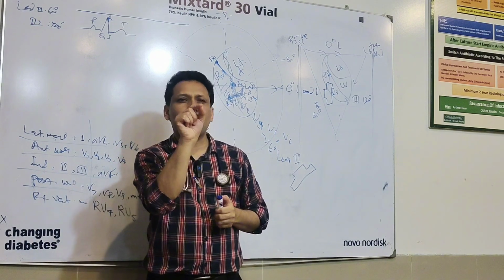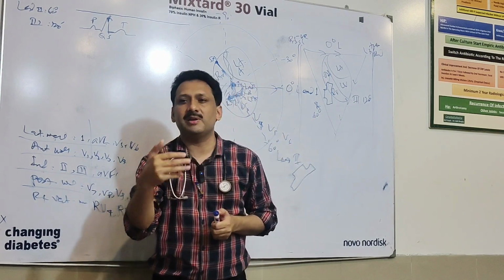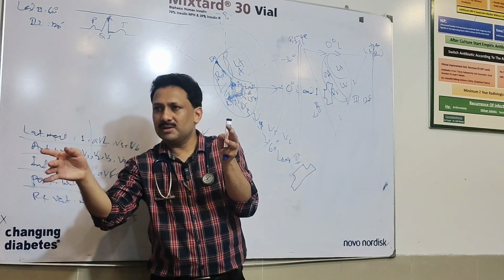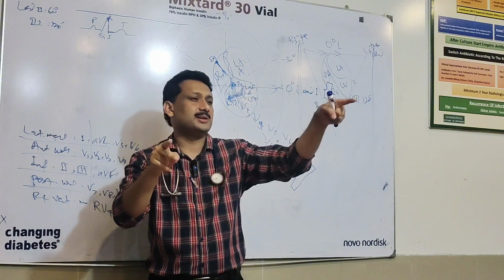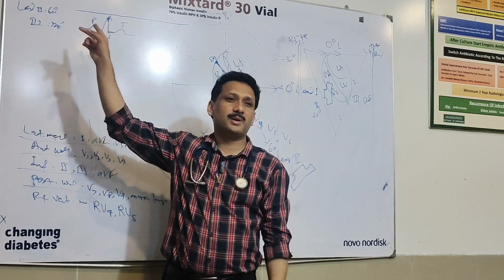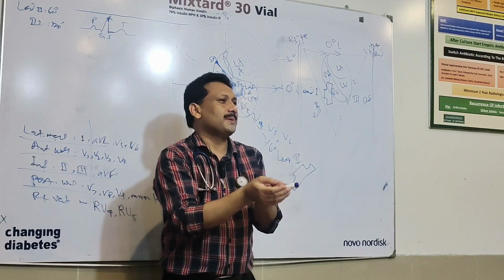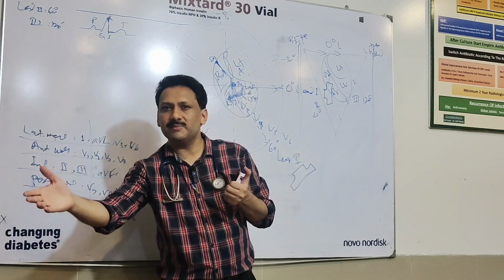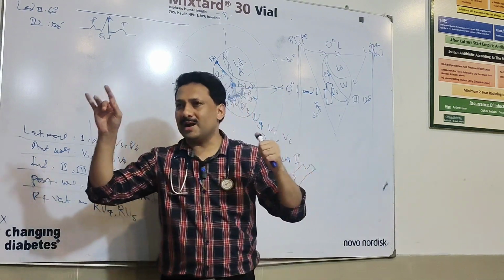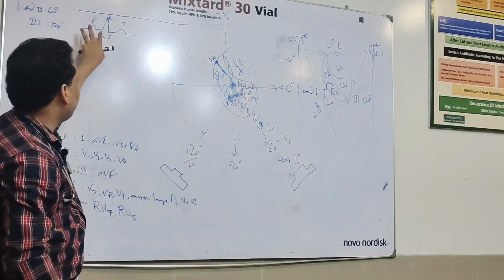And the waves which it forms on the paper are thermal waves. So what is happening here? Electrical energy is being converted to mechanical energy, which is being converted to thermal energy, and you see this waveform. If somebody asks how it is happening, it's as simple as that. As per the rules of physics, one form of energy can be converted to another form of energy. So electrical energy is being converted to mechanical energy, and then to thermal waves on that paper.